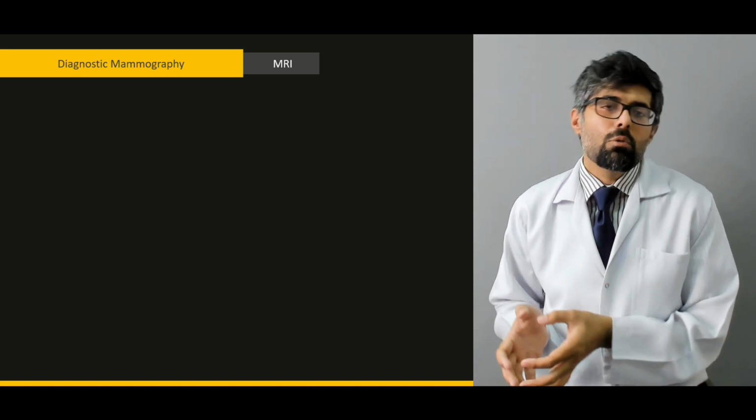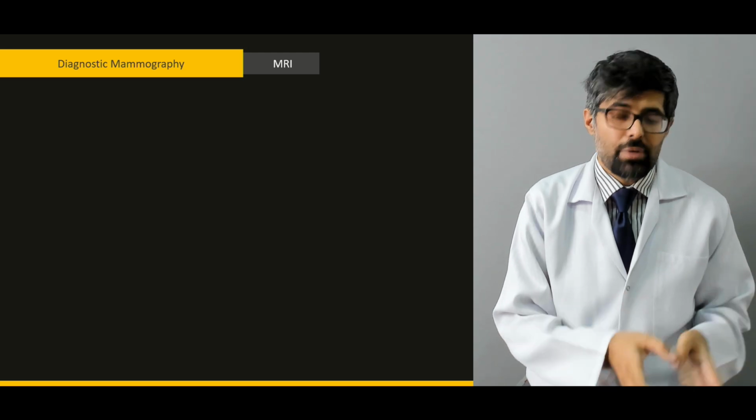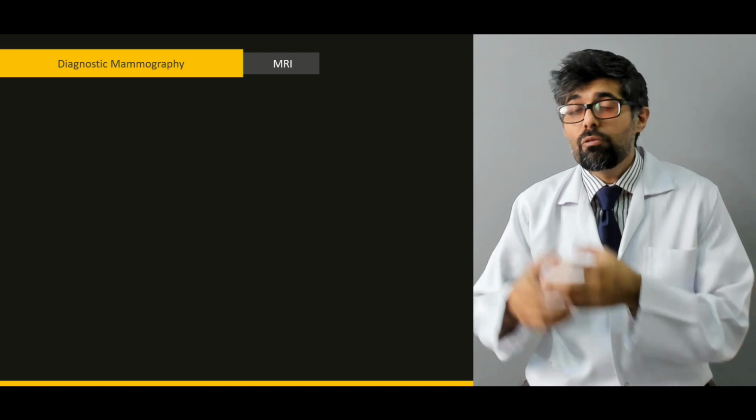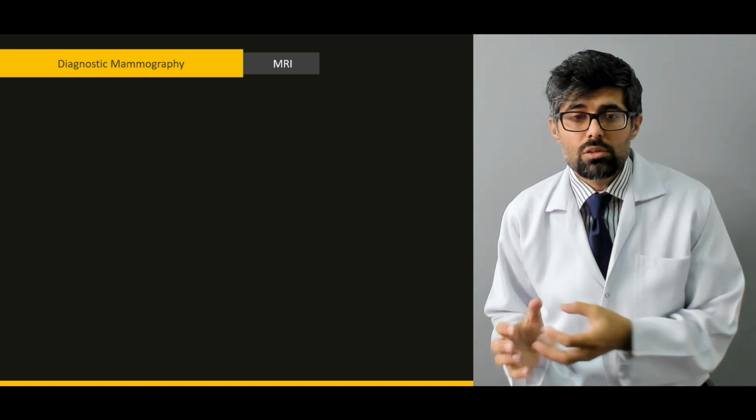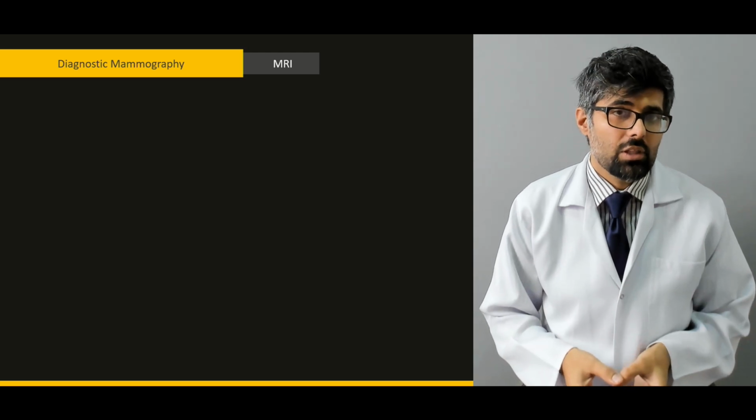Now, screening mammography is only done as a tool for early detection of breast cancers. It is not done as a tool for definitive diagnosis. For definitive diagnosis, a diagnostic mammogram is done.